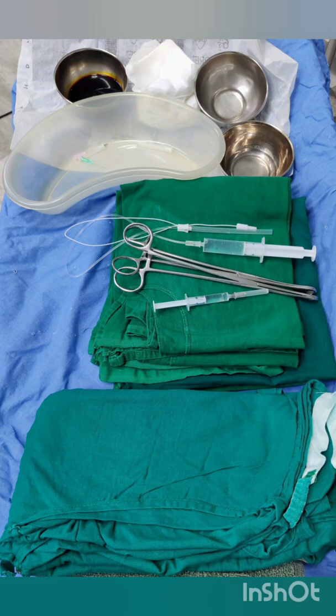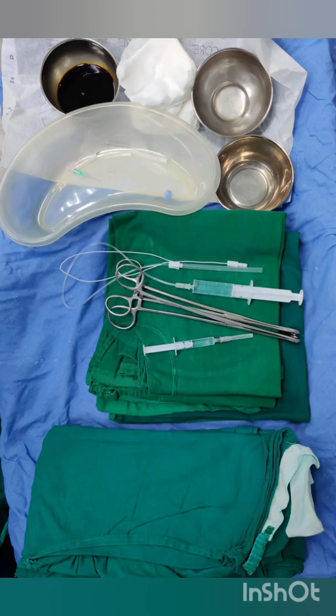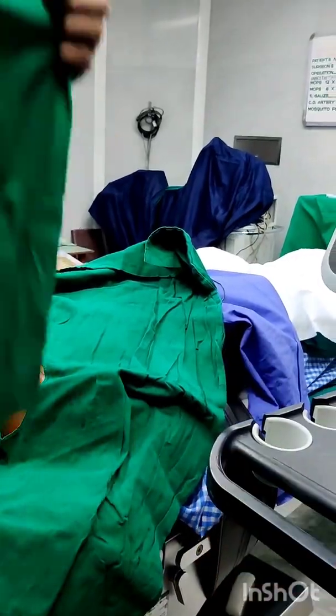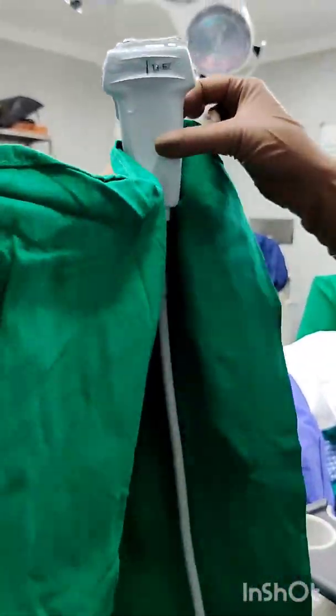Here for the block, I have taken 10 ml of 0.5% bupivacaine plus 10 ml of 2% plain lignocaine. I am using a 50 mm 22 gauge block needle with 10 cm extension for injection. High frequency linear probe is ideal for scanning small superficial structures.